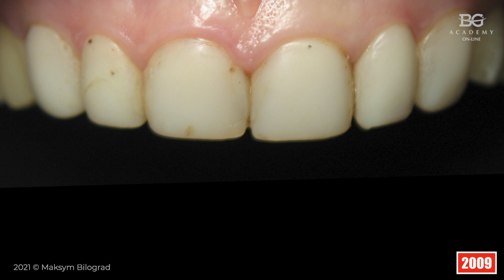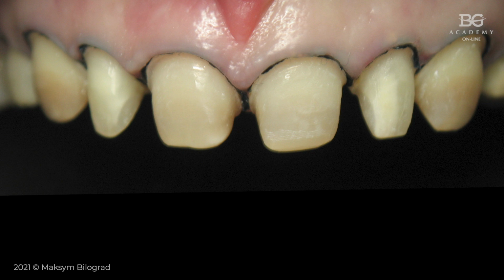I said, "Okay, perfect." But before doing the final veneers, my condition of this deal was to make provisional restorations in white color, and let her test drive them for at least a week to make a final decision that this color fits her. I removed the composite restorations. By the way, these are composite crowns or semi-crowns, because the teeth were restored with composite from all sides. Here is the buccal view. They were also wrapped around from the palatal side, so we removed all this composite, and also the caries underneath.